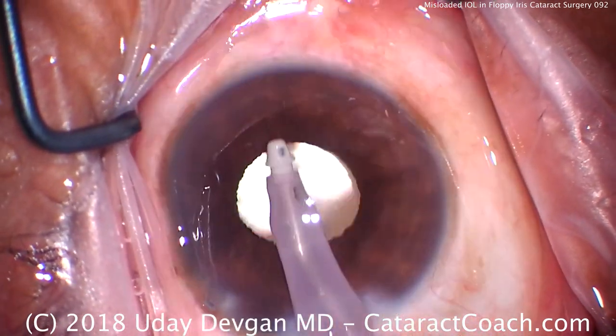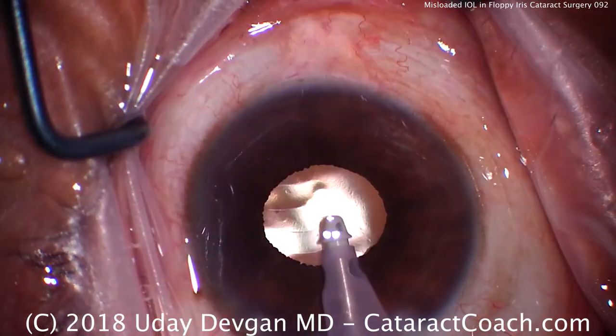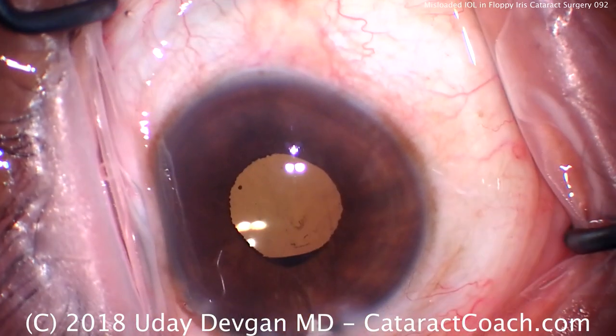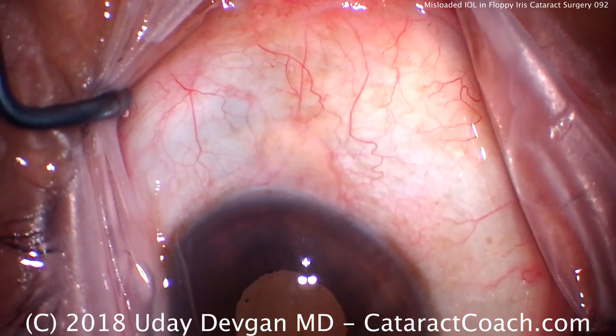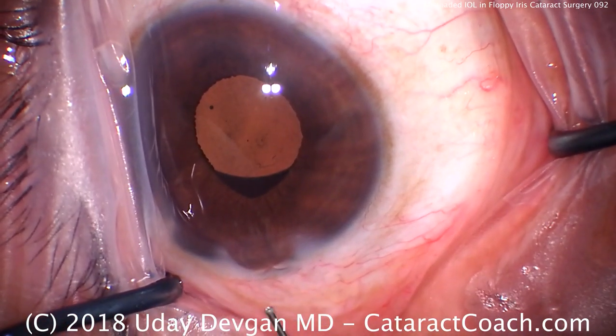The lens looks good, in the proper position, and viscoelastic is removed from the eye. As we come out of the eye, even if we come out slowly, look what happens — we get prolapse of the iris in the incision.